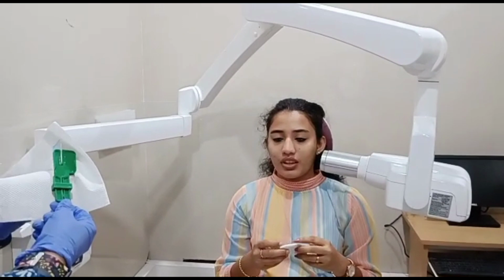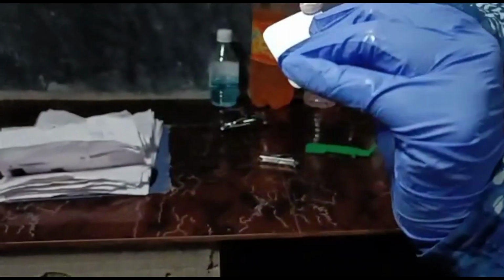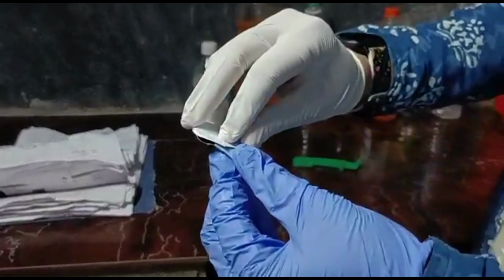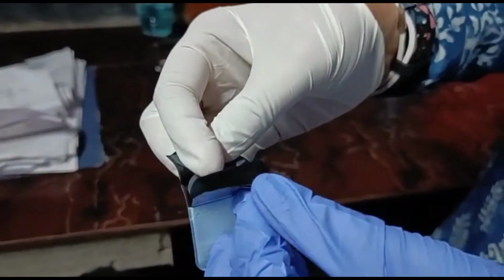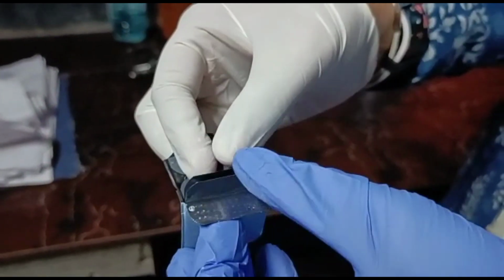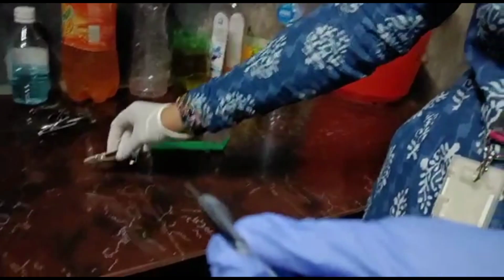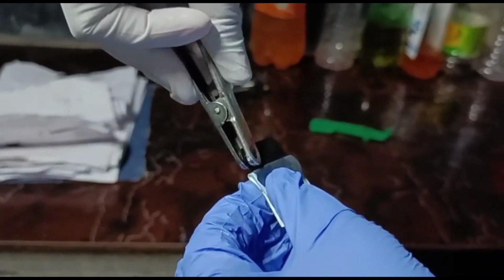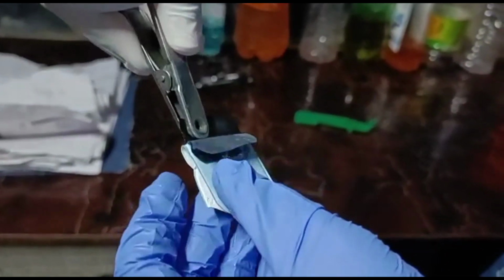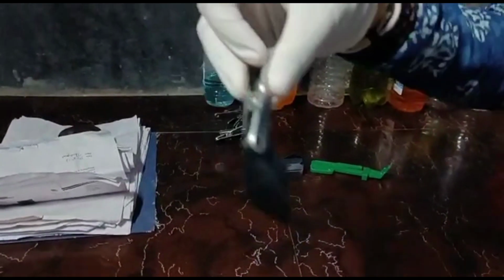Next, we go for the processing. We do it in the darkroom setup. I'm just showing a demo in the light setup itself, where the film has already been exposed and processed. This has to be done in the darkroom with no light, and here I'm placing the clipper on the occlusal dot surface, and then I'm removing the film from its cover, and then I'm going for the processing.